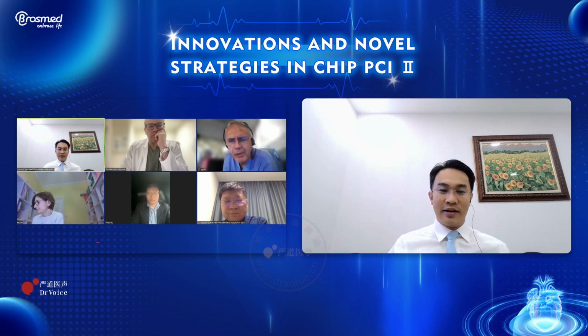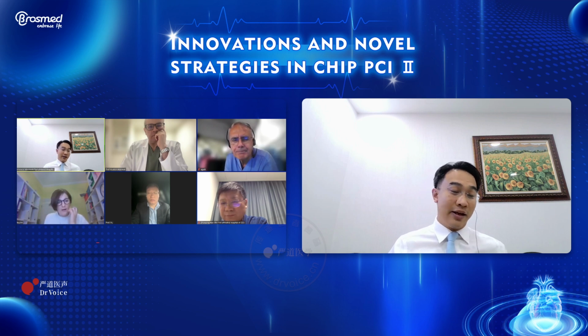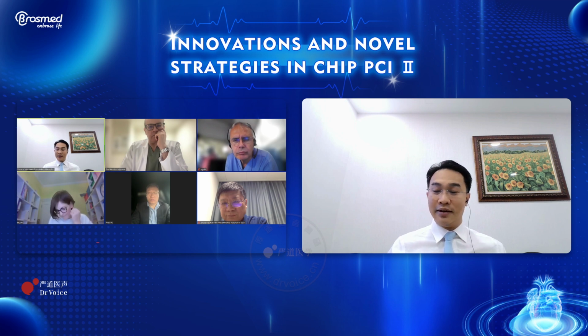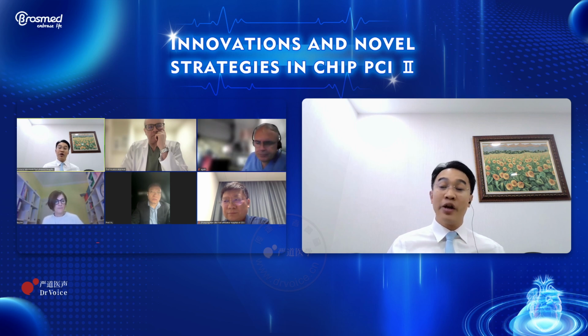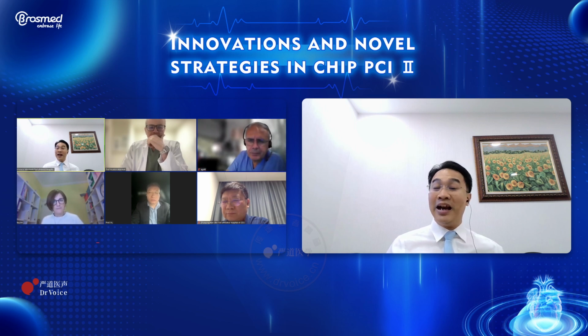Thank you for your question. I think this case was performed a very long time ago, but now we have ADR cases more frequently. So after we learn to do ADR cases, we have to learn how to manage these intramural hematomas. Nowadays we don't put very long stents. If we have a very long intramural hematoma, we try to use the cutting balloon first to make the re-entry, and we can reduce the number of stents, and we don't put very long ones.